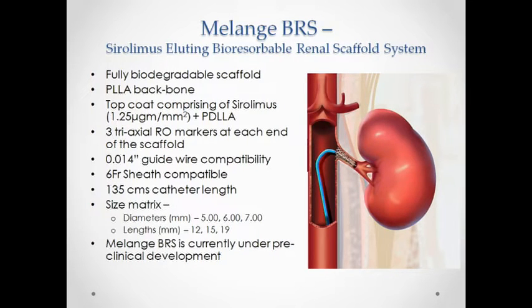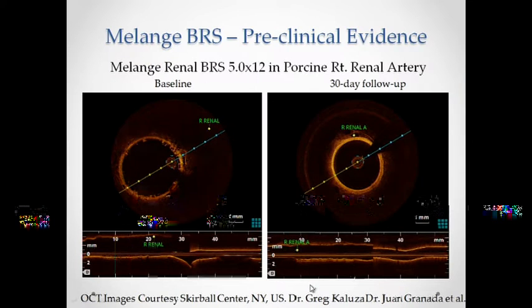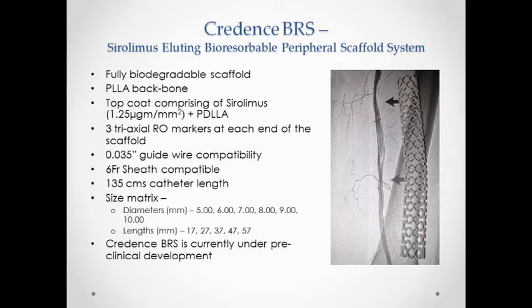I think we are definitely not gearing up for another stent here. I know some people might be thinking stent within stent. But that will induce recurrent disease, and the next time when we go in, we'll have more problems. So stents don't really improve the long term outcome. That looks better. Not getting a good picture here, though.